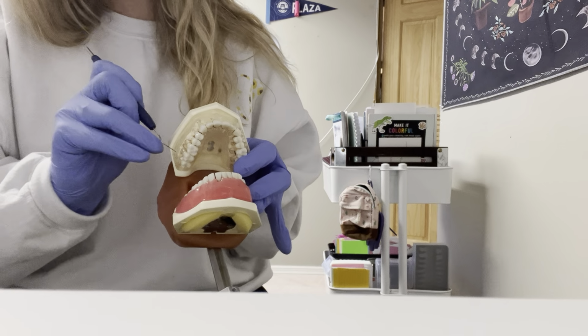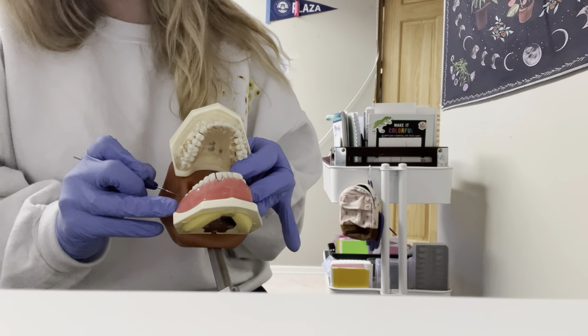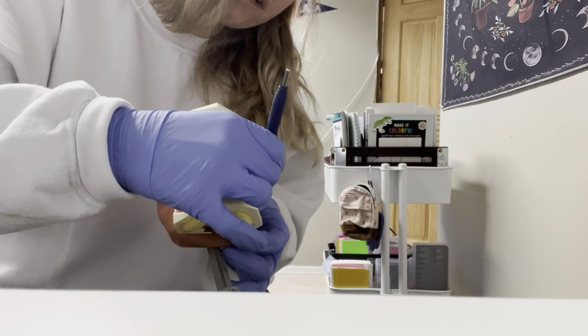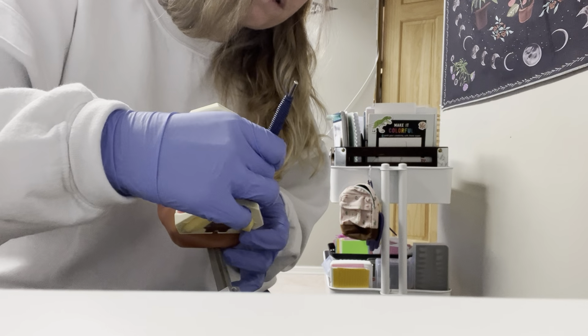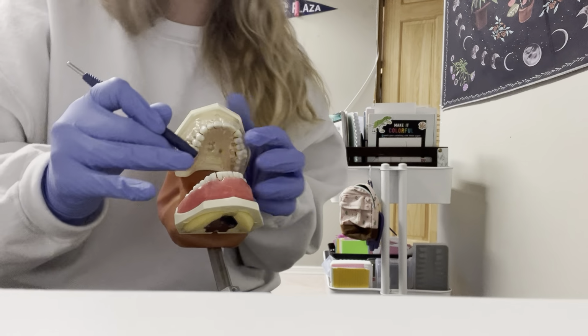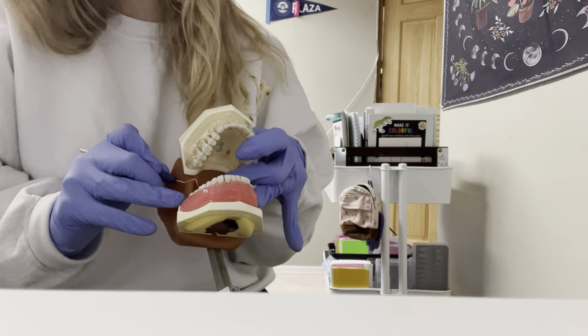After that, you're going to drop down to the lower right. You're going to start at tooth number 32, the buccal side, and do the buccal of all of the mandible. Then you're going to end at tooth number 17, buccal, and then you're going to go to tooth number 17, lingual. You're going to do the lingual of all the teeth, and then you're going to end at the lingual of tooth number 32.